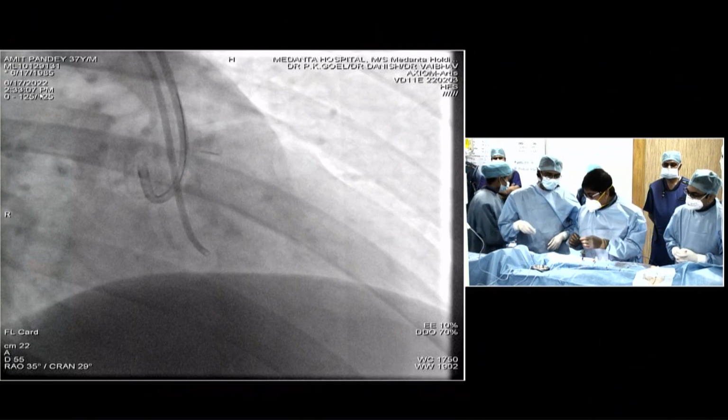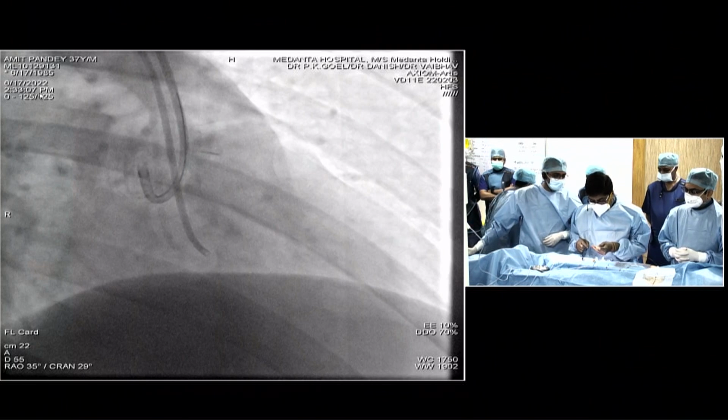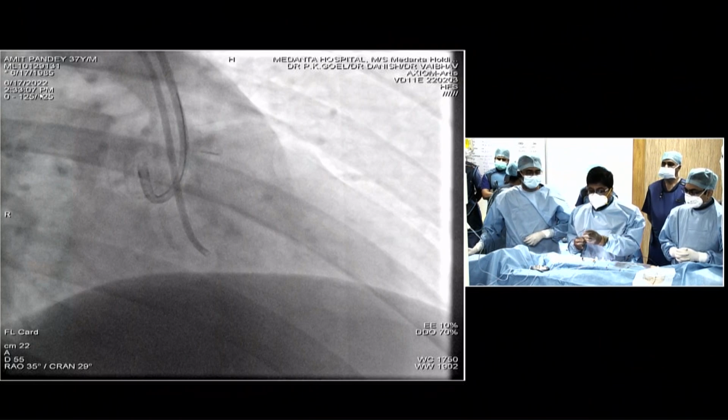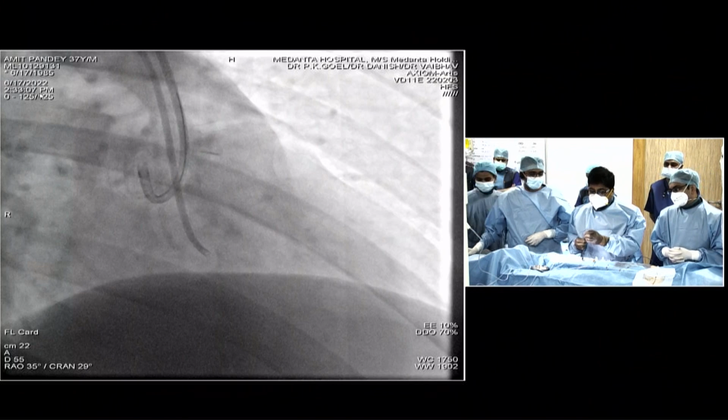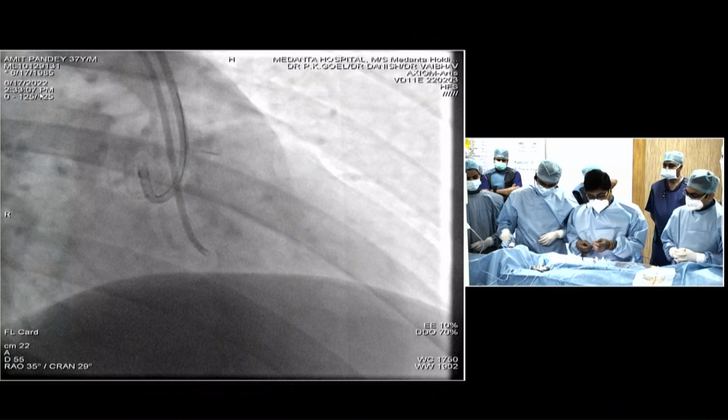And the Corsair is radio opaque all through, as you know, the distal 20 centimeters, so visibility is not as good. So I feel for antegrades, the Caravel or FineCross may be fine. How do you feel about Corsair Pro?